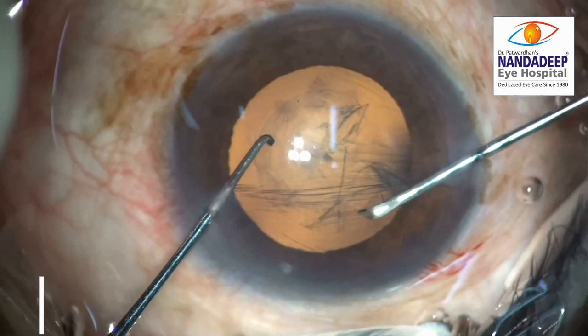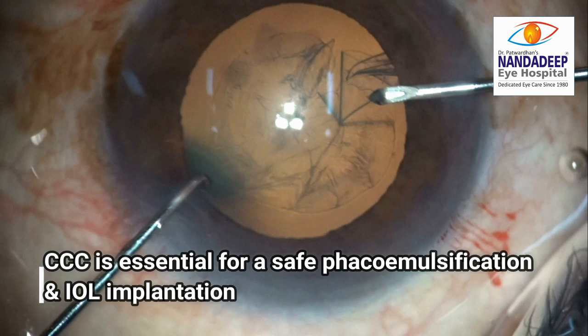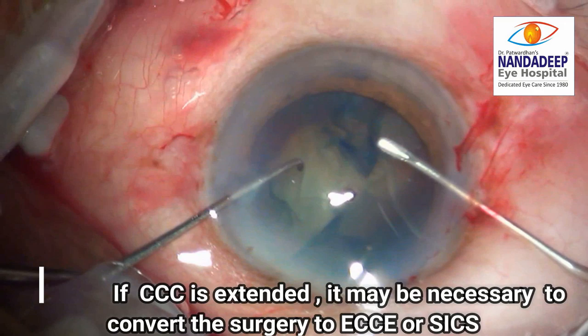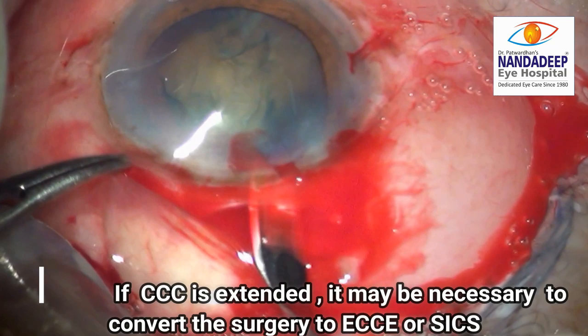In this video, I am going to present a revolutionary technique of CCC retrieval from the zonules. CCC is one of the most important steps of phacoemulsification. An incomplete or non-continuous CCC may result in the extension of tear towards the posterior capsule during phacoemulsification. In cases where the CCC is extended, the surgeon may have to decide to convert to an extracapsular cataract extraction or a small incision cataract surgery.